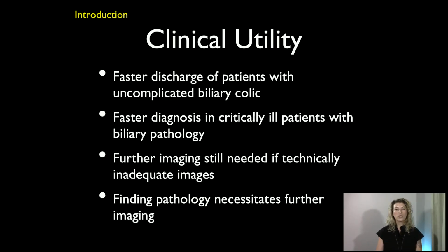So the question is always, why would we use this? And the answer is because it increases satisfaction for patients because it decreases length of stay in the emergency department and decreases length of time to diagnosis. So patients with uncomplicated biliary colic, you can diagnose them right at the bedside, control their symptoms, and they can leave. They don't have to stay. But for patients who are critically ill and remain undifferentiated, it can be extremely helpful for diagnosis there.